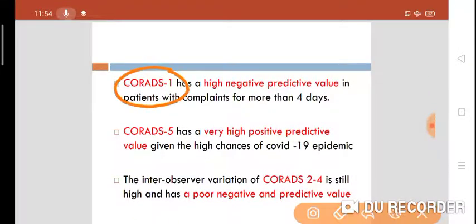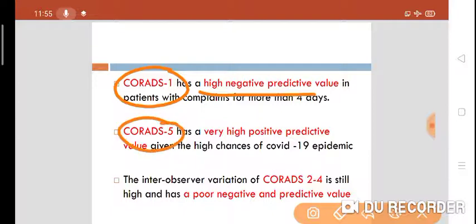CO-RADS score 1 has a very high negative predictive value in patients with complaints for more than 4 days after exposure or contact with a positive patient or after symptom onset. When CO-RADS score is 5, it shows a very high probability of COVID-19 illness and a high chance of COVID-19 in an epidemic or pandemic setting.